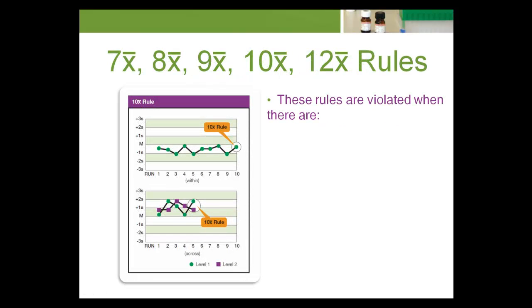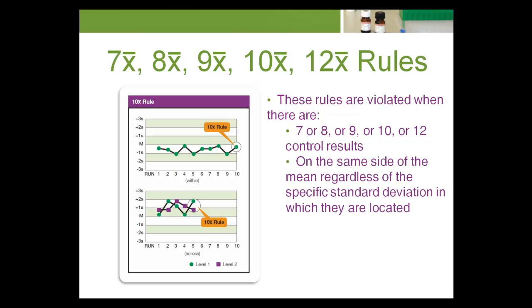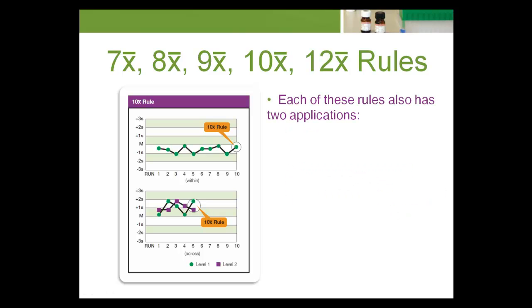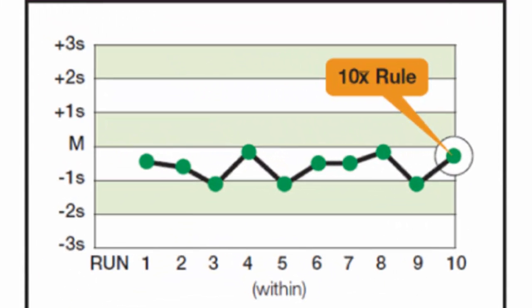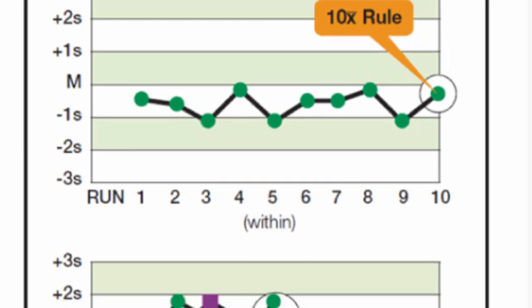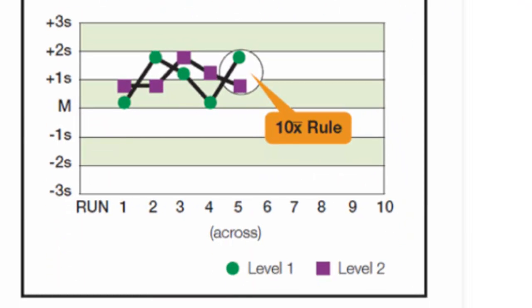The 7x, 8x, 9x, 10x, or 12x rules are violated when there are 7, 8, 9, 10, or 12 control results on the same side of the mean, regardless of the specific standard deviation in which they are located. Each of these rules also has two applications: within control material (e.g., all level 1 control results) or across control materials (e.g., level 1, 2, and 3 in combination). Within control material violations indicate systematic bias in a single area of the method curve, while across control materials violations indicate systematic bias over a broader concentration range.